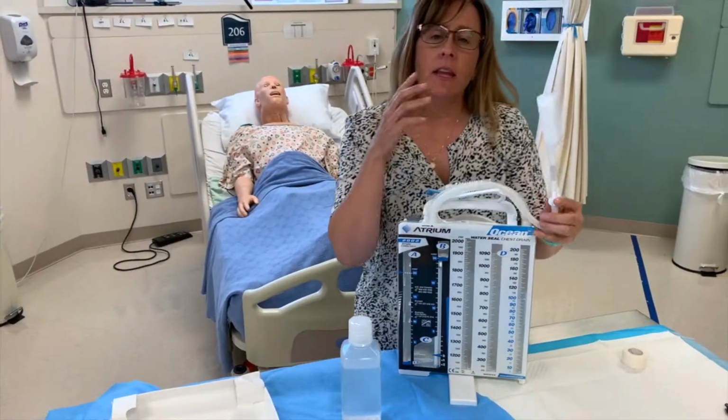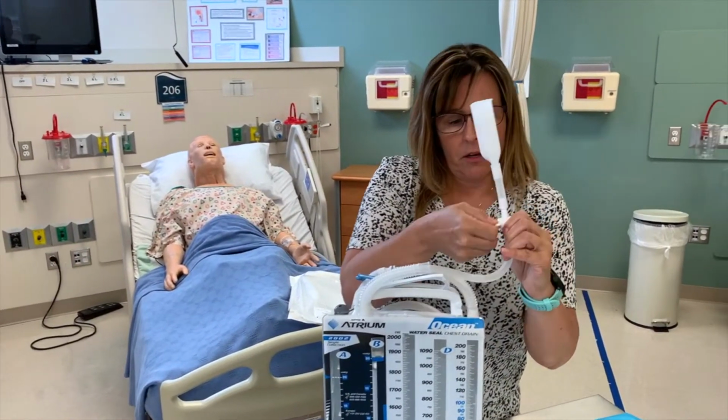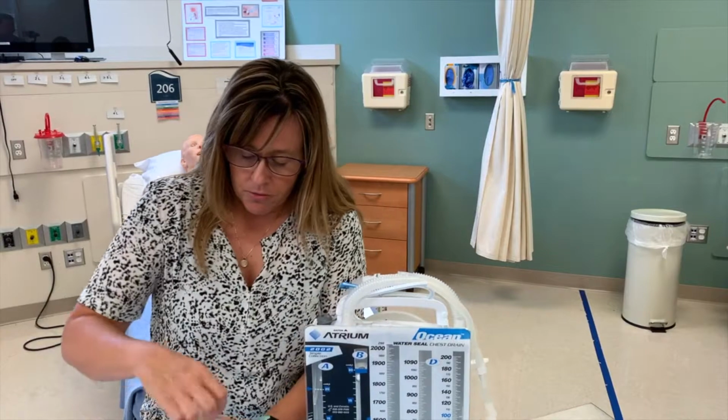In the actual lecture today, we talked about kinking the tubing. Well, you can kink the tubing, or there's an actual stopcock here that's going to allow you to open it or close it. So this is closed, so we're going to go ahead and do that first. Open your sterile water.